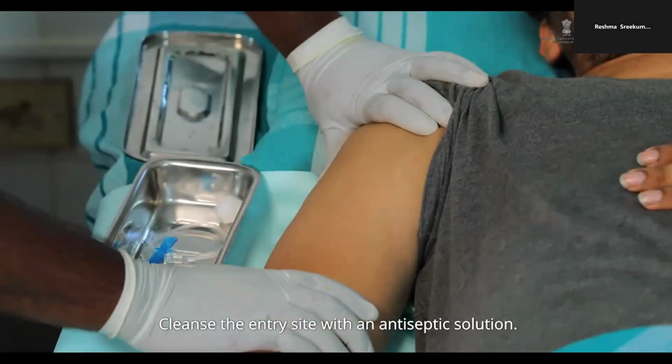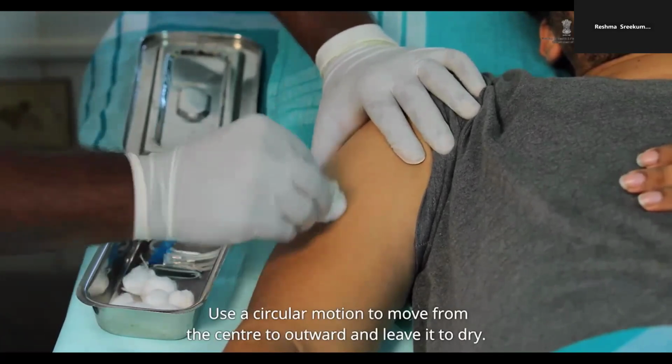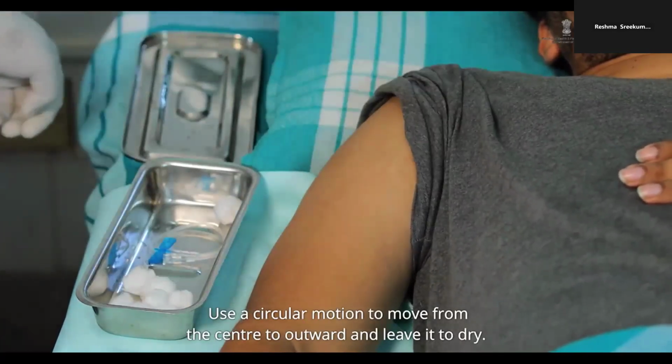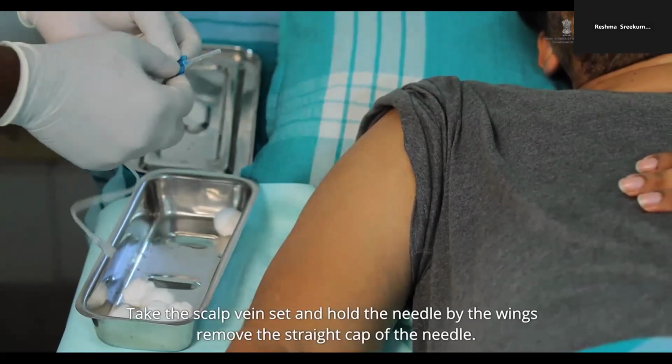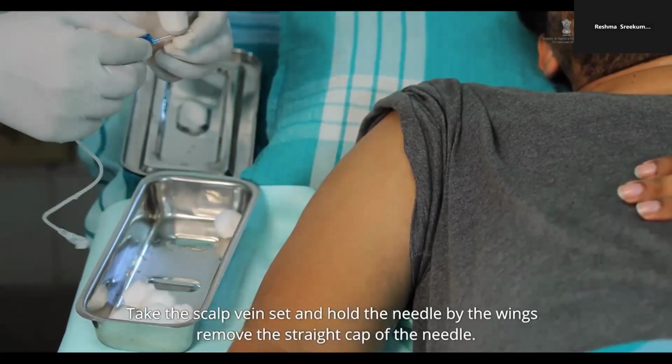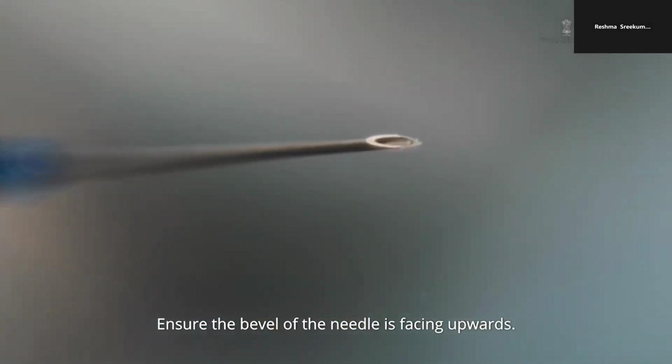Cleanse the entry site with an antiseptic solution. Use a circular motion to move from the center to outward and leave it to dry. Take the scalp vein set and hold the needle by the wings. Remove the straight cap of the needle. Ensure the bevel of the needle is facing upwards.